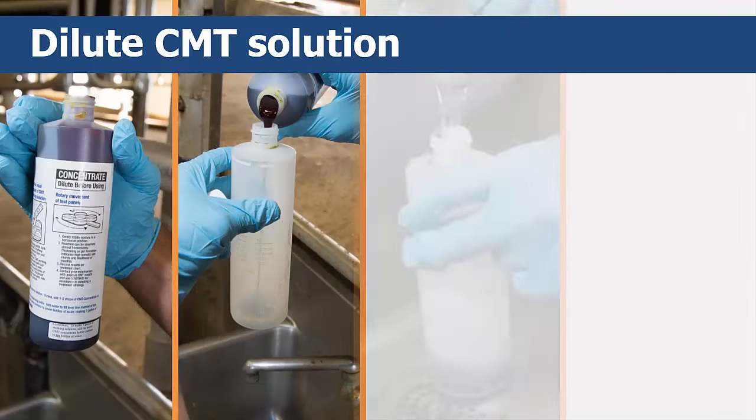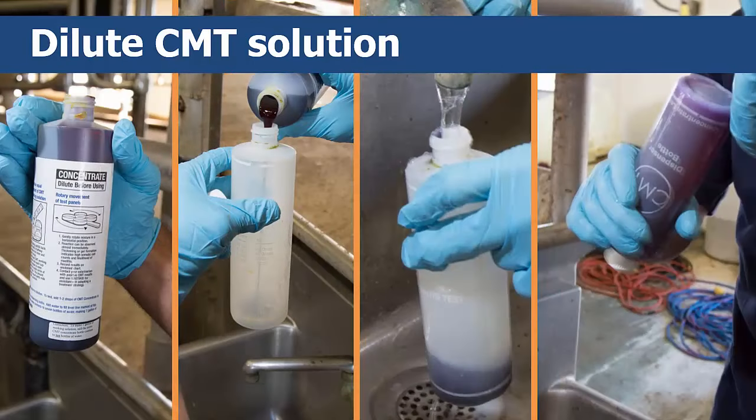It's helpful to have the CMT solution ready before you need it, so go ahead and prepare it according to the instructions on the package. CMT solution is purple and comes in a concentrated form. You need to use the diluted solution to obtain the test results. Set it aside.